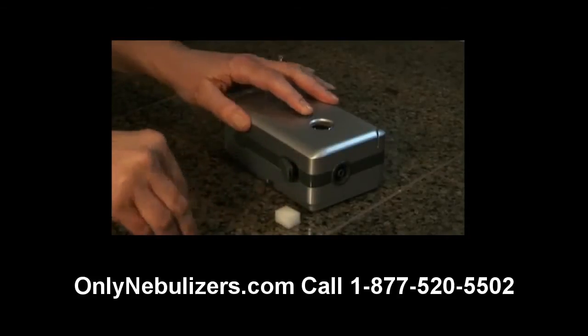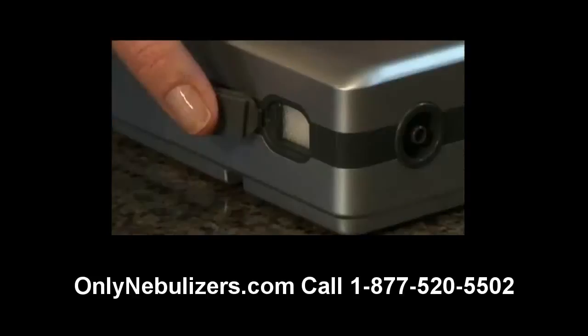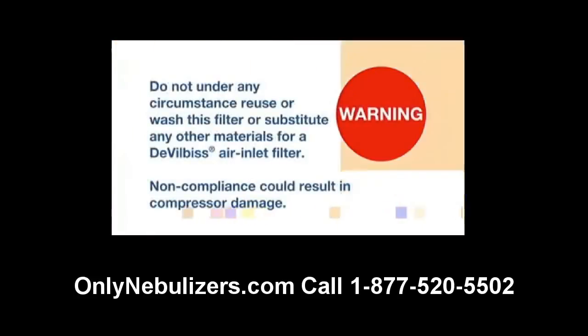Remove the filter and then replace with a new filter. Please note that the Traveler filter cover tab should remain attached to the Traveler and should not be entirely removed. Do not under any circumstance reuse or wash this filter, or substitute any other materials for a DeVilbiss air inlet filter. Non-compliance could result in compressor damage.